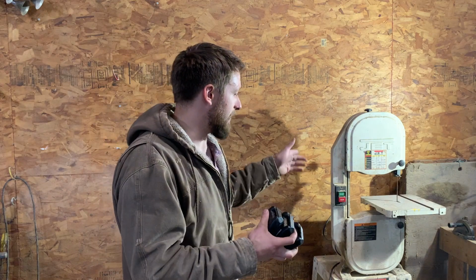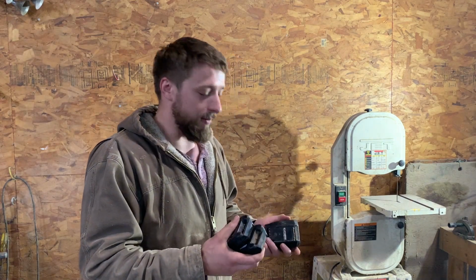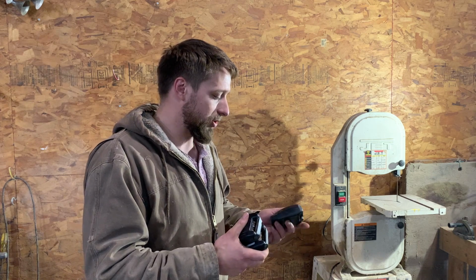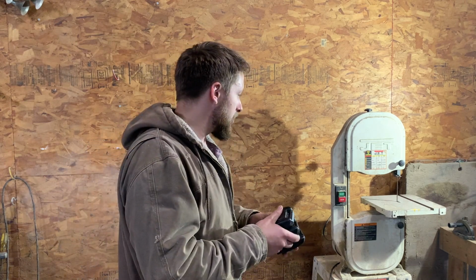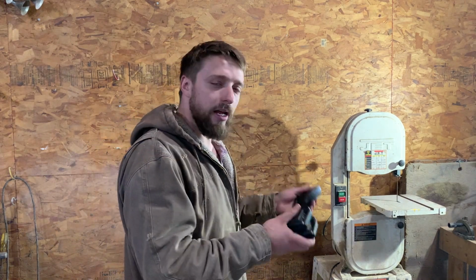So first off, I have a bandsaw. That's what I have in our shop. It seems for me to work the best, and I'll show you the process, what to avoid, different glue to use, different batteries, and so forth. So step one is to start cutting them open, and I'll show you how to do that.